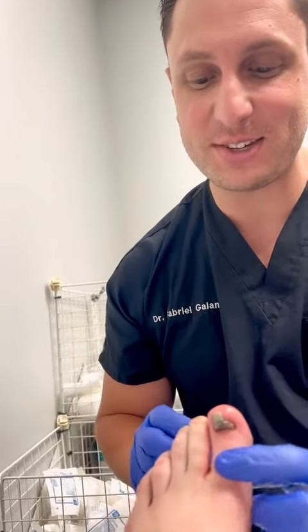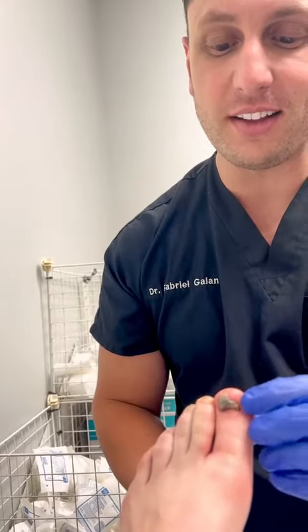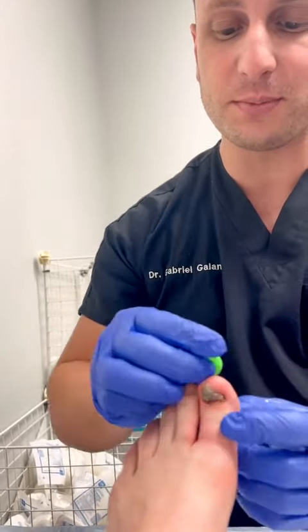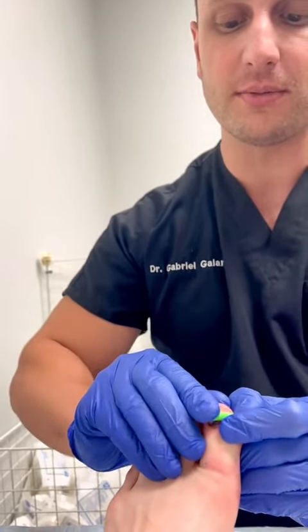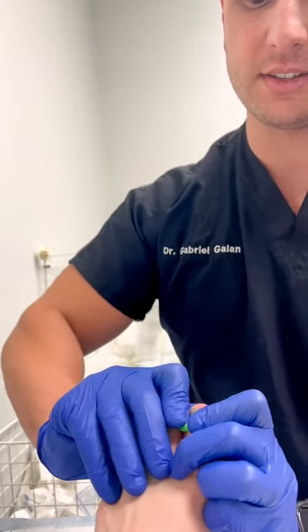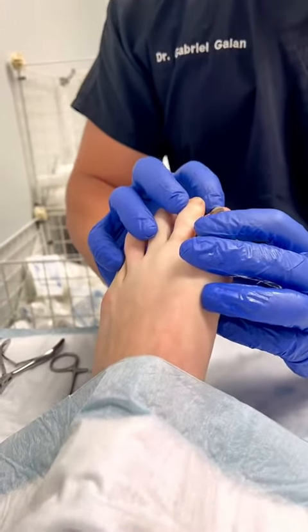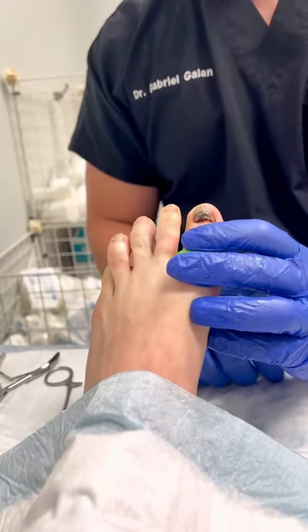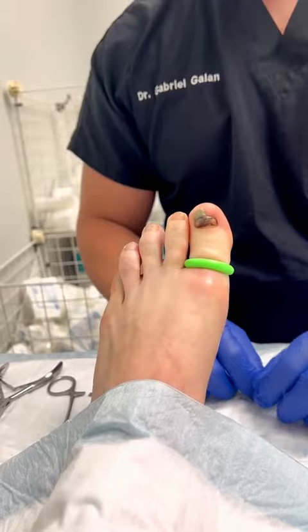We have a patient coming in today with a really painful big toenail. This patient has worn a boot that's caused a lot of blood blisters to form underneath the toe. It's happened multiple times, and as a consequence, she's developed this gnarly-looking toenail that has a lot of dried blood underneath, and it's painful for the patient. We've just put on our little toe tourniquet, and we're going to remove this toenail today.